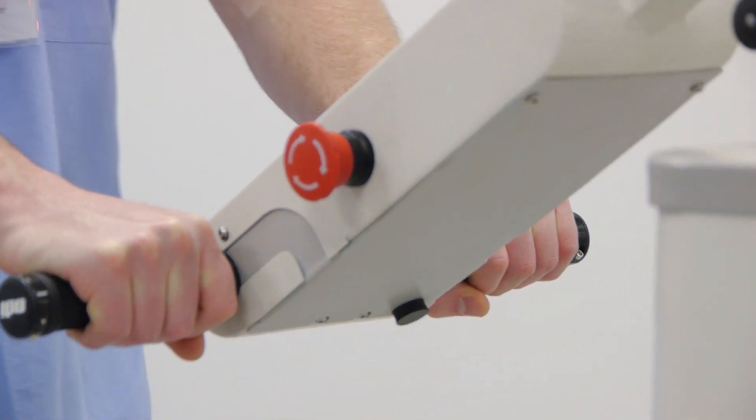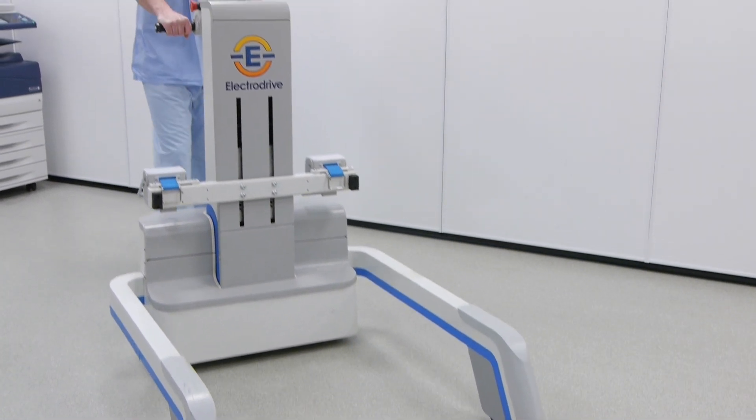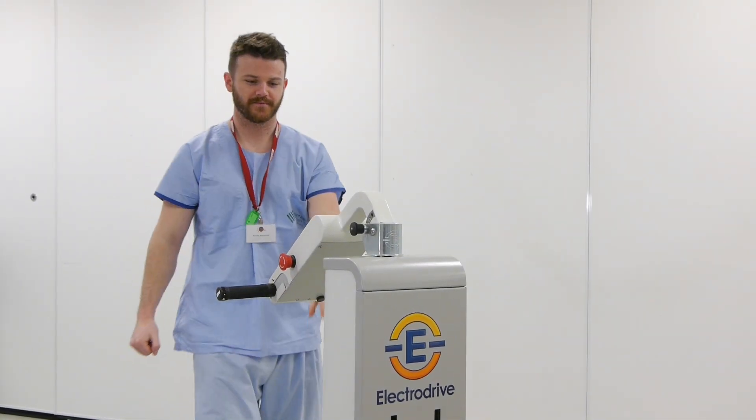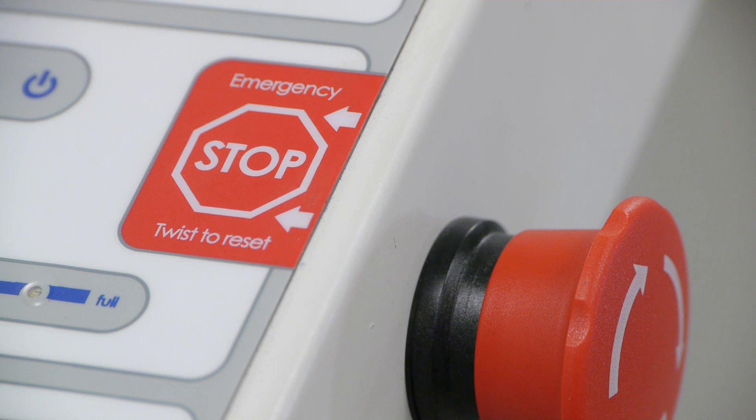While we're on the topic of stopping, let's have a look at that big red button on the control panel. Press it and the machine stops and turns off automatically. To restart, twist the button clockwise, as indicated by the arrows, and the machine comes back to life, ready for service.